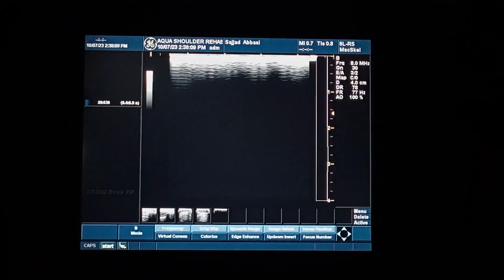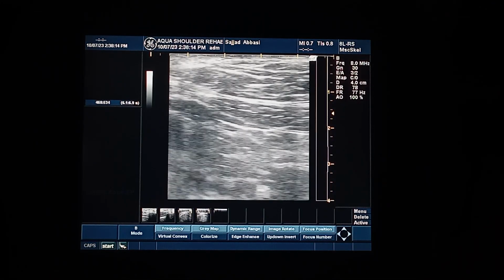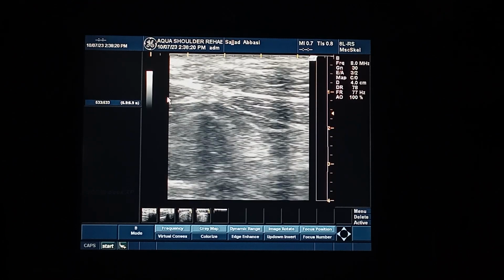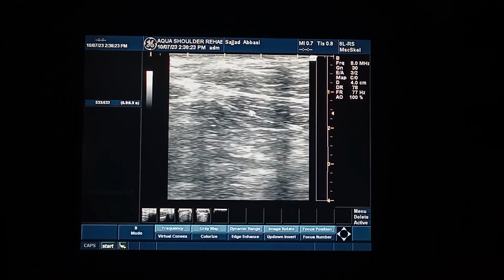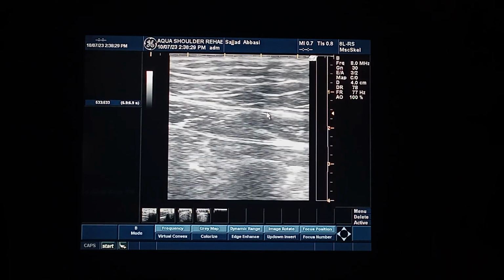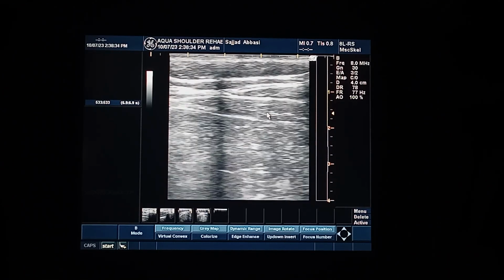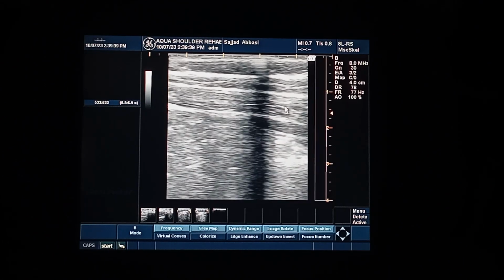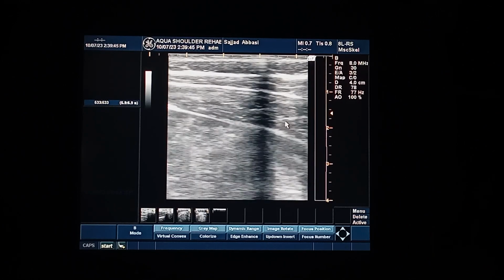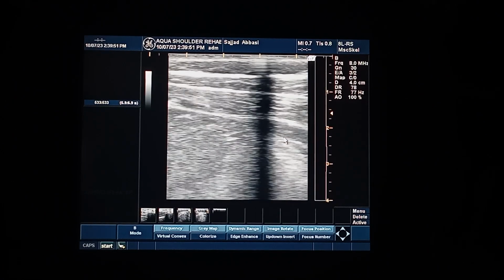Okay, so let's find out the rectus abdominis again in the midline. You can clearly point out this white portion. This white is basically the linea alba, and from this white, this is my rectus abdominis. When I approach my rectus abdominis and go laterally, I should see three muscles, and here I can see three lines: external oblique, internal oblique, and transversus abdominis. As soon as I'm pulling my tummy inside, this is transversus abdominis that is working.